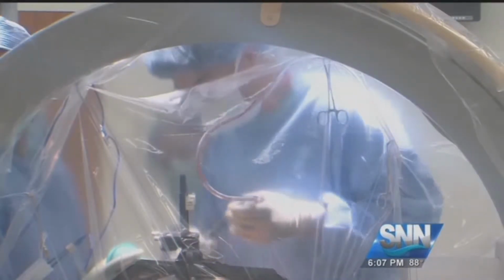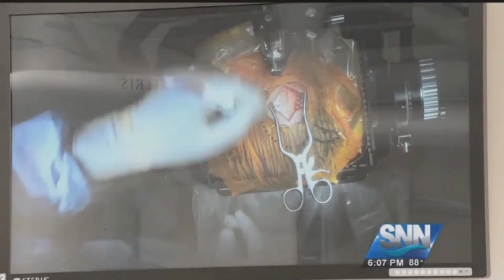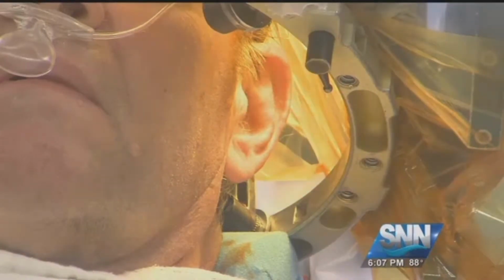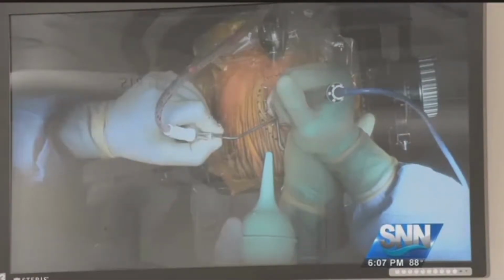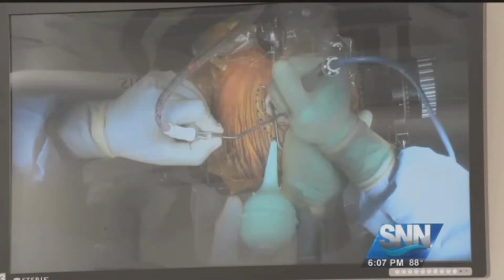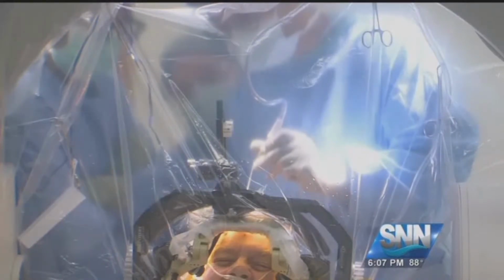Intuitively, that sounds really scary and really painful. I promise it won't hurt, it's just loud. Until they get in there and realize, oh my gosh, this really doesn't hurt. It's just so counterintuitive to think that you could have a hole drilled in your head. All right, here we go. And something pass through your brain. Get the covering of the brain out of the way so we can see and have it not hurt.